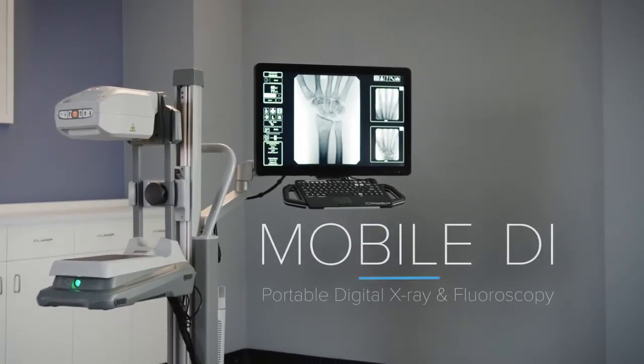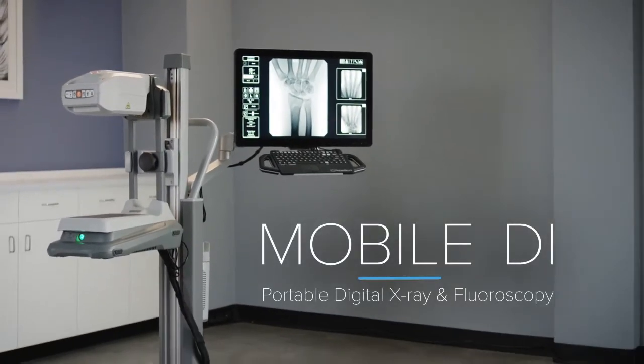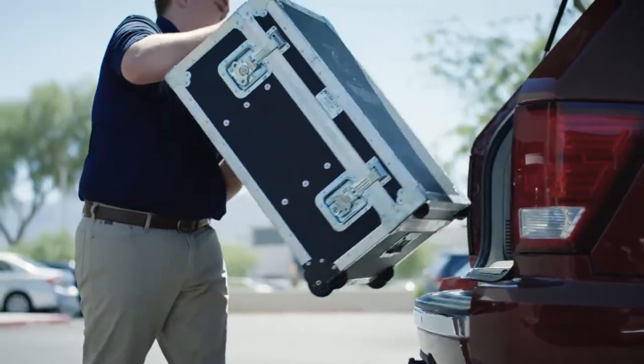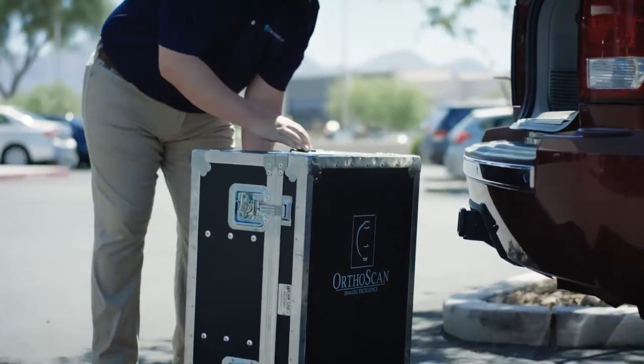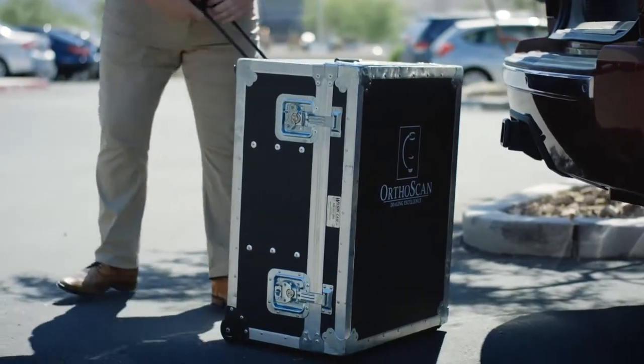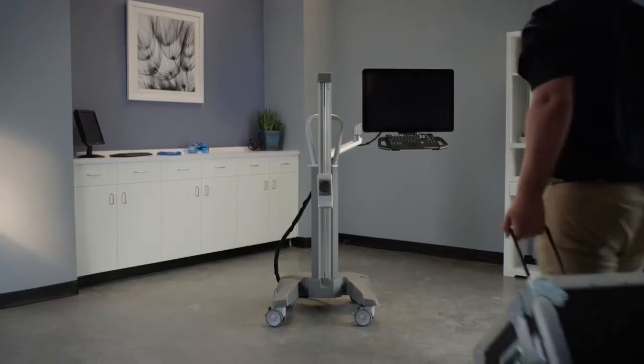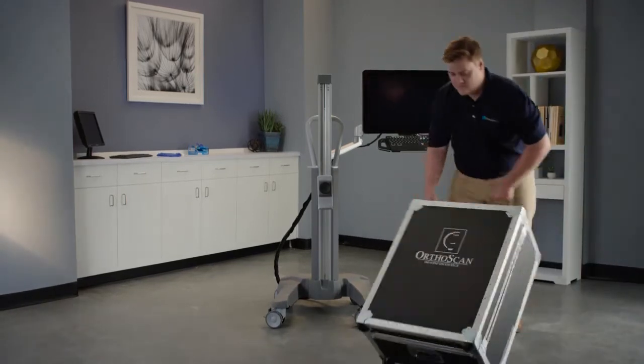Mobile DI is the perfect solution for portable digital x-ray and fluoroscopy. Weighing only 35 pounds, Mobile DI is the most compact mini C-arm on the market today. Using the custom wheeled storage case, it can be easily transported between satellite locations.